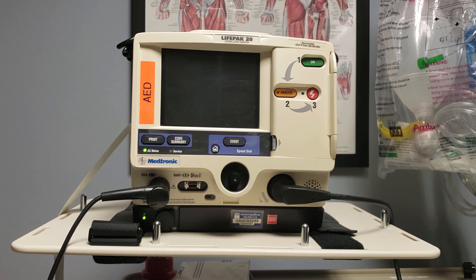Just like we learned in BLS, if you find the patient down, one of your first concerns is going to be high quality CPR. So while you're doing compressions and you've called out to that first person, 'Bring me the crash cart and the AED,' this is what's going to arrive — your LifePak 20.